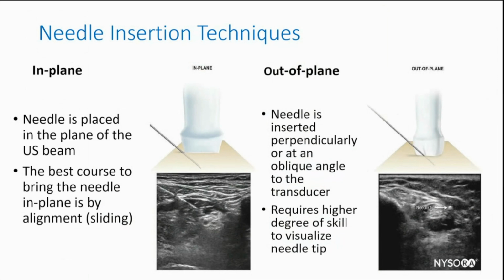I have never tried to look into the manual, but based on my experience experimenting with the button, I find that using the penetration mode is the best when it comes to visualizing the middle to lower half of the screen, which I think is maybe because when you put it in the penetration mode, it probably puts it at a lower frequency, and therefore you have a bit better penetration for the deeper structures.